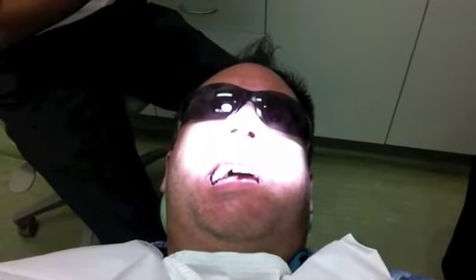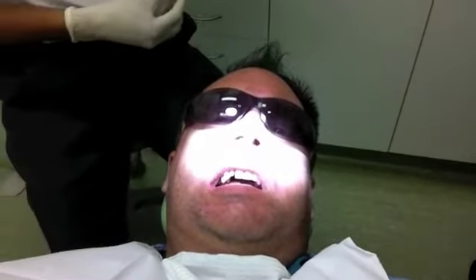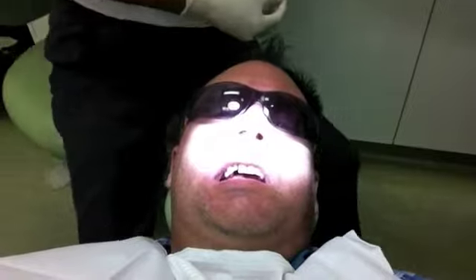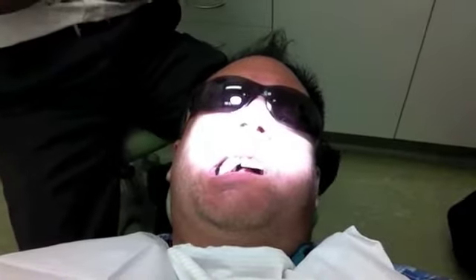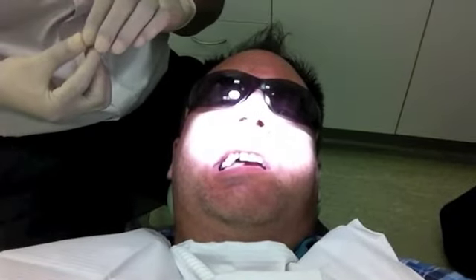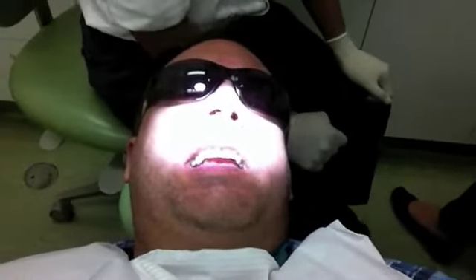In that case, we need something as A2 as possible, A3 as possible, so we use that. Actually, what colour is that, Nicole? It's pretty cool. I can actually watch myself because I'm using the iPhone. Can you do it? Look at that. Instant tooth.